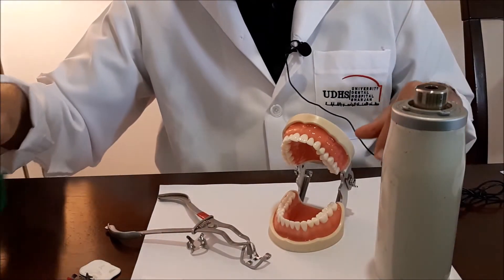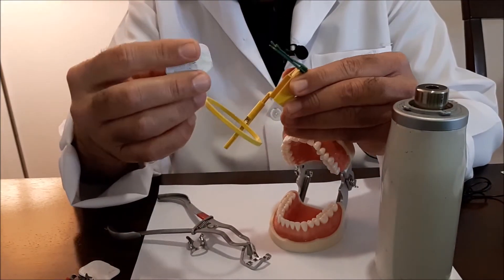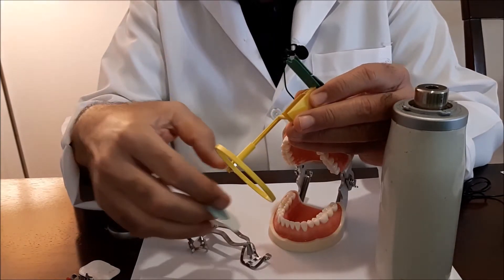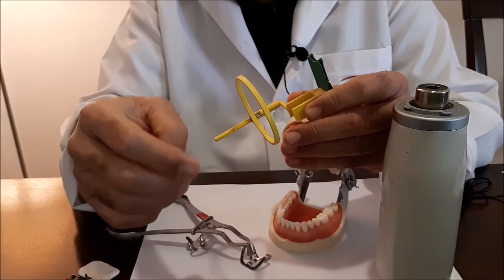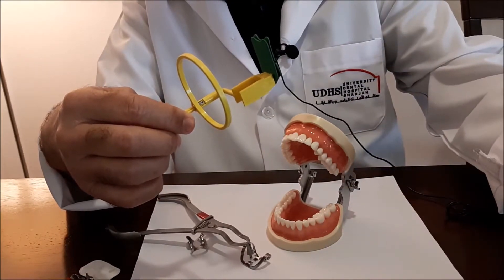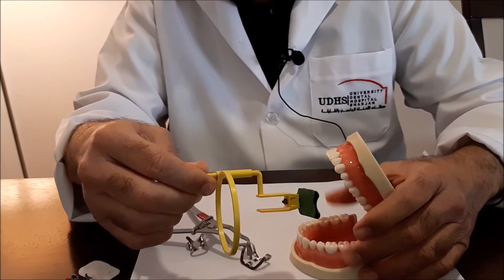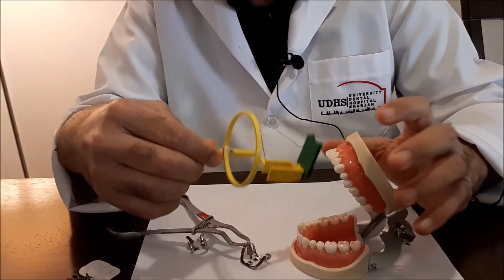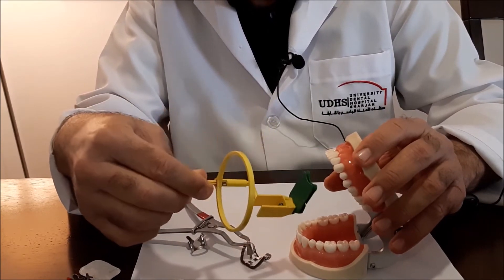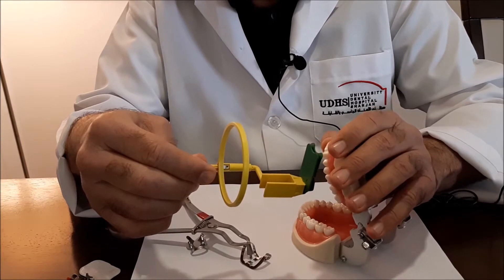In this series of videos we will be discussing the sensor holders which are used either for analog films or for PSP plates. They are the same because they are of the same thickness and size. We will divide the discussion into the interior, upper and lower, and the posterior teeth, and we will start with the upper anterior teeth.